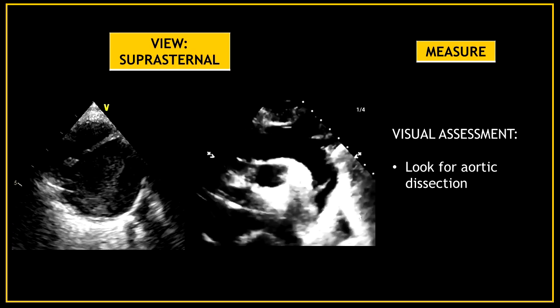This is also a very important view to look for any abnormalities of the aorta. During the visual assessment, look for any aortic dissection. In this image you can see an aortic dissection flap on the descending aorta.